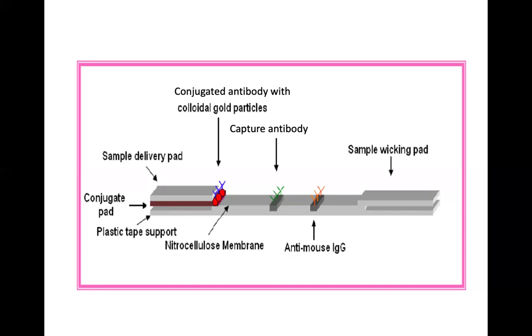So you have to characterize the architecture of the lateral flow as well. It's not just about how much biomarker, or how much capture antibody here, how much capture antibody here. It's not about how much, it's also about the architecture of the lateral flow. Okay, so tomorrow you will be learning the hands-on.